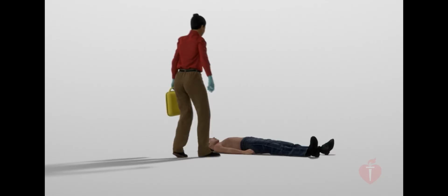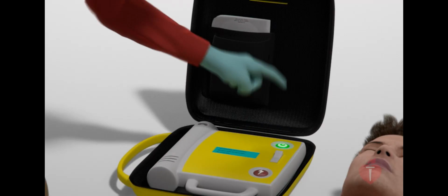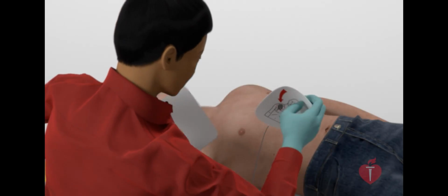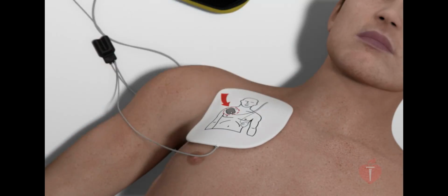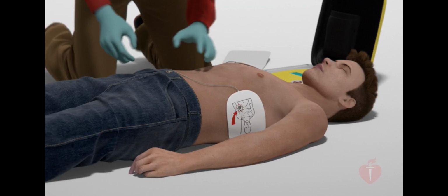Following this demonstration, you will have a chance to practice using an AED trainer, just so you can see what it's like. You'll start with your hands in place to give compressions, and the AED will arrive immediately. First, turn on the AED by pushing the on button or opening the lid. Attach pads to patient's bare chest. Follow the AED prompts and the pictures on the package or pads. Plug in pads connector.